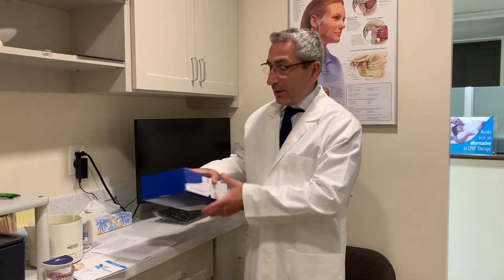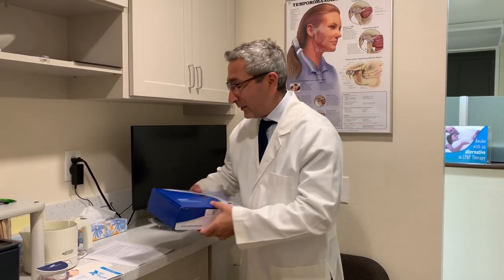Hello, I'm Dr. Demergen. I am making this video to go over the instructions and how to use your dental sleep appliance from Somnomed.